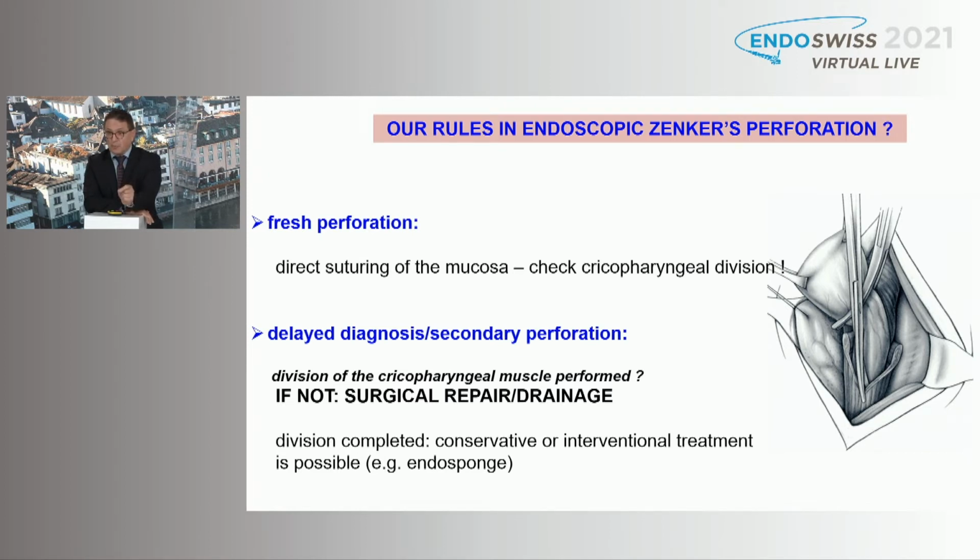Did you perform the myotomy? Because we have two ways then. If the myotomy was performed, and Stefan answered to me, "For sure, I performed the myotomy," I said, okay, then we can do conservative treatment. In this case, he will show you the treatment.